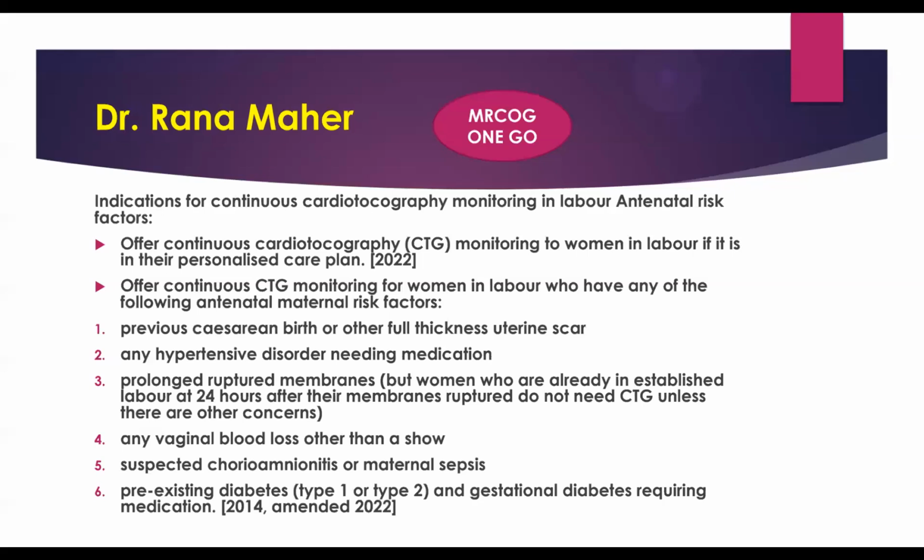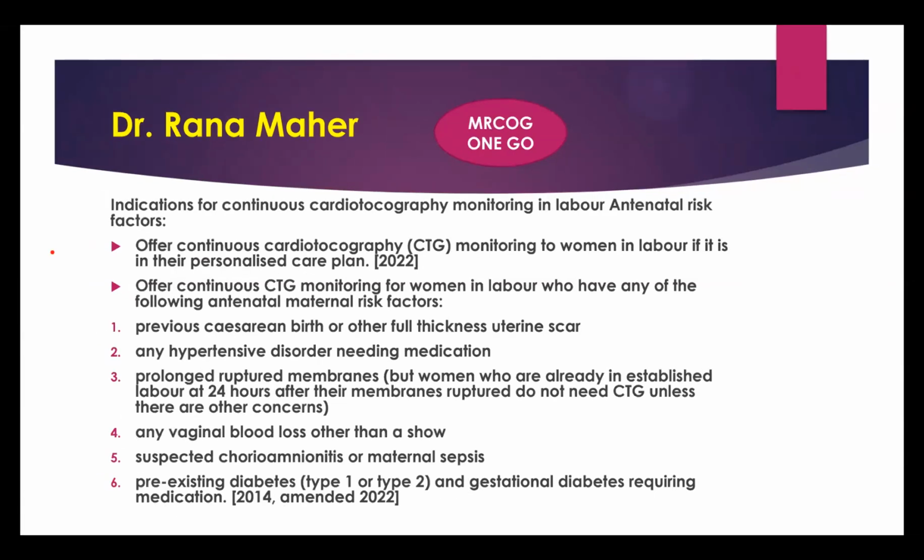What about the indications for continuous CTG? Either it's a personalized decision, as we mentioned in the previous slide, or we have any problem with the mother herself, risk in the mother or risk in the baby. So we will offer continuous CTG monitoring to women in labor if it's in their personalized care plan. So this is the first indication.